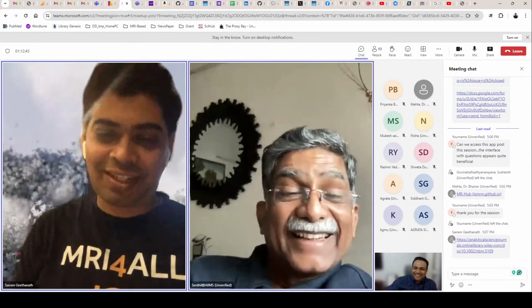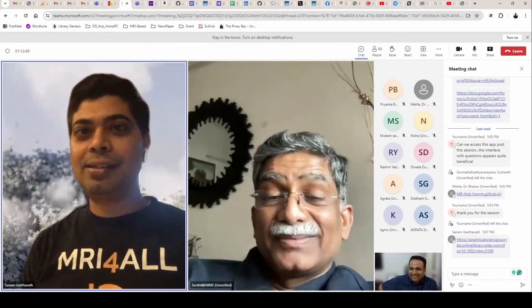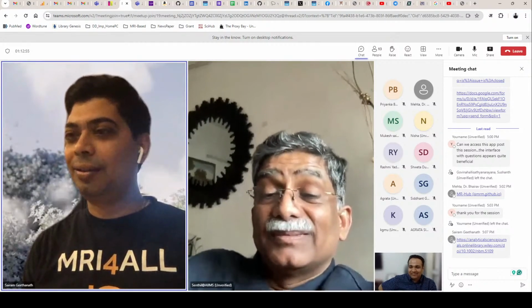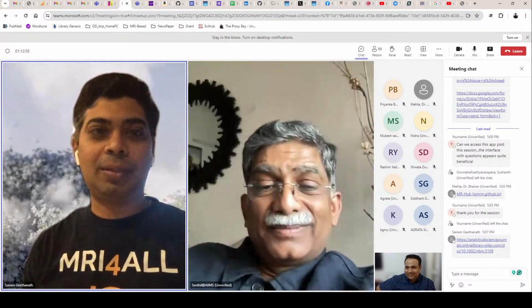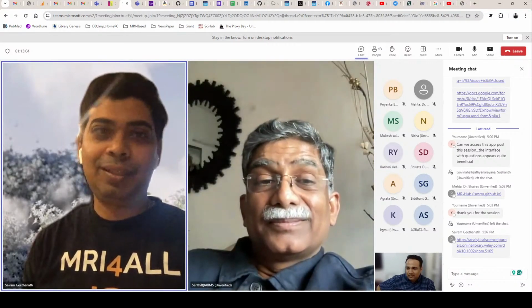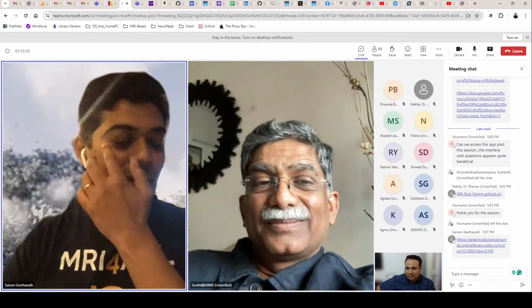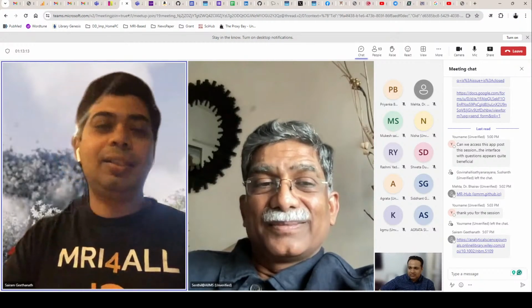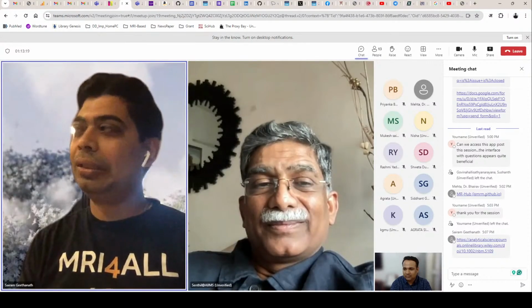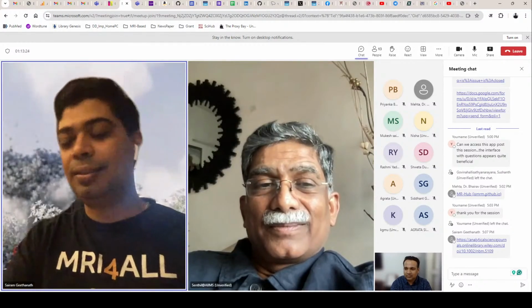Yeah, I was just trying to wear this to promote building community scanners. This is something that I'm passionate about, and I hope at some point in India we get an opportunity to build one of these tabletop scanners in due course. But I want to advertise MRI for all. Here's my shameless shout out to everybody. If you have time, please go to mriforall.org, which will take you to the GitHub website and show you how to build your own MR scanner. Right now, I think it will cost about 6 to 8 lakh rupees, but you can actually build your own scanner.